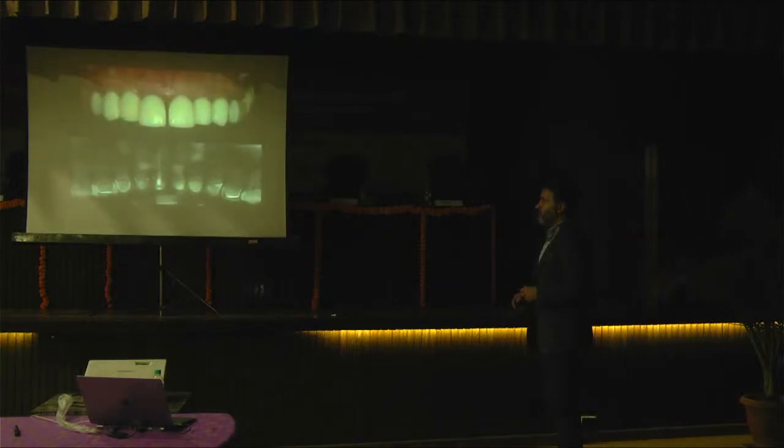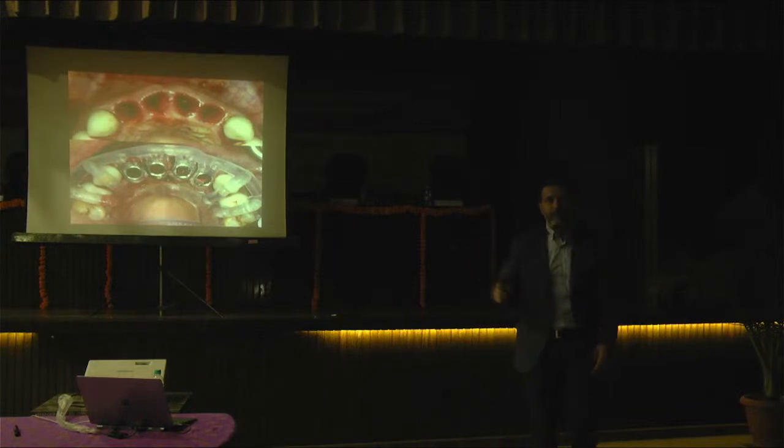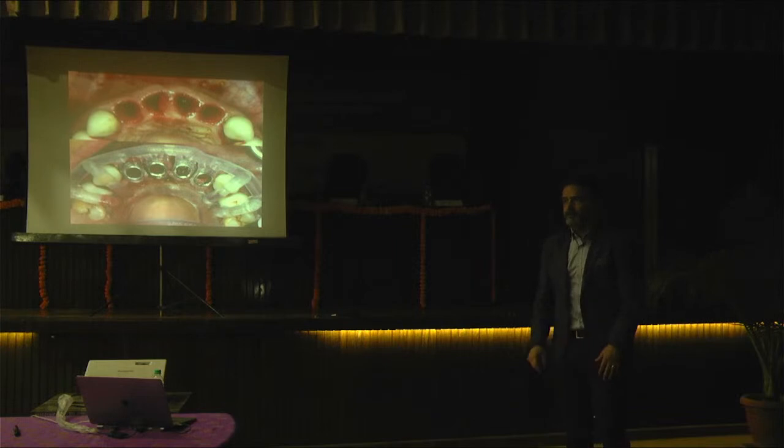And what did we do? We made the extraction because they have a periodontal problem, and after it, sorry about the views because of the light. If we close the light, you can see it more clearly, but it's your choice to choose.